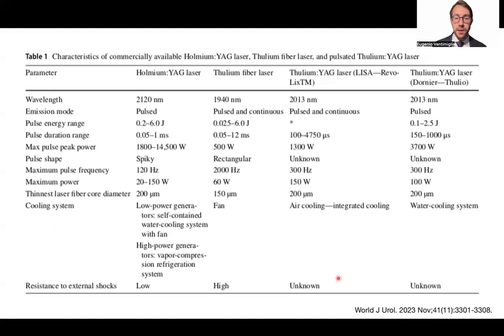It's a lot of numbers, and you find here the publication if you want to look at them a little bit more relaxed, but still different wavelengths, different absorptions by the water. Lasers can work in pulsated ways, some of them only pulsated, some of them can work also as continuous laser.